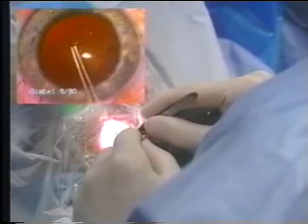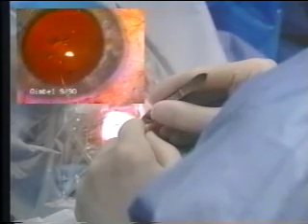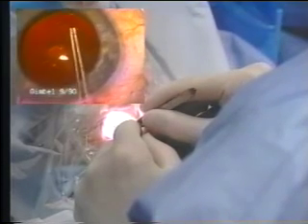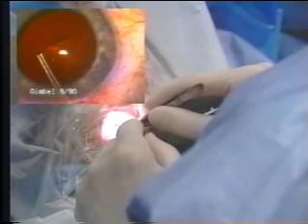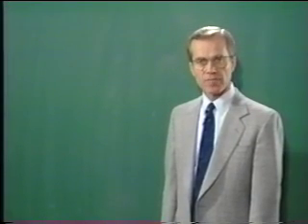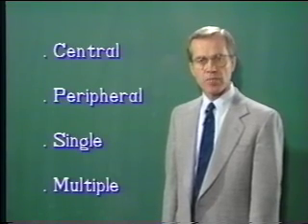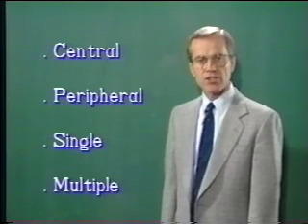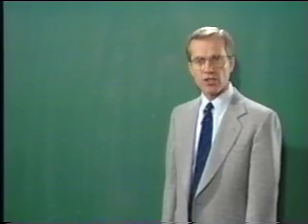Once the tear is started, it is re-grasped in multiple positions to control the direction of the tear. Notice the hand position and movements, again with the wound as the fulcrum, and the left hand helping to stabilize the forceps. The initial puncture can theoretically be made anywhere on the capsule, but I recommend a central puncture. Some surgeons start at the diameter of the capsulorhexis, but this has the danger of creating a discontinuity in the edge and difficulty completing with a smooth edge.